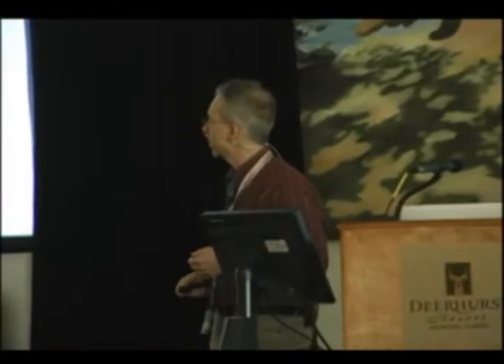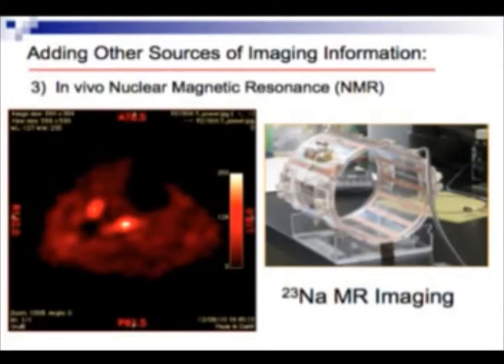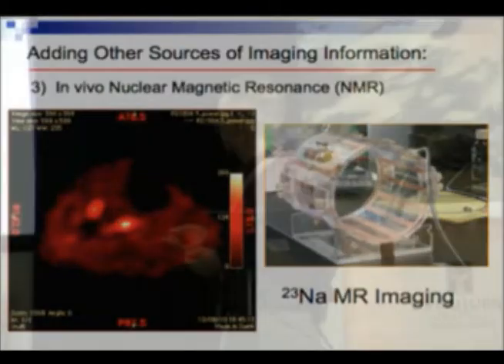So I showed you that osteosarcoma earlier. We can also bring in other sources of magnetic resonance imaging data. So one of my students, Ali Reza Akbari, made a sodium imaging coil. With MRI, we're not just restricted to doing stuff with hydrogen, which is how all the clinical MRIs are based around hydrogen or water. We can image other nuclei as well for free. We just got to build the hardware, which is no problem in my lab.